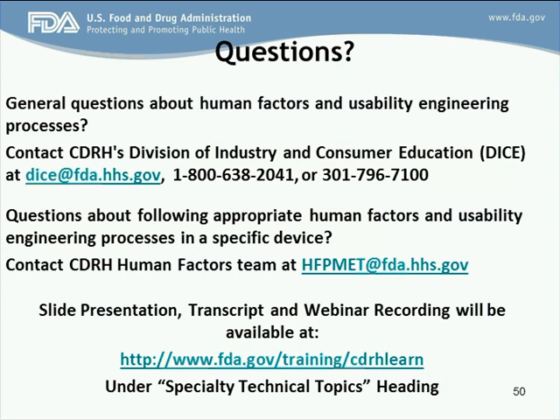Hi. I work for a division of a company that makes software medical devices, and I had a question regarding the timing of the human factors studies and data. Typically, design validation, which early in the presentation you emphasized that human factors fell under, is done toward the end when your design has been locked down. But modern software development is iterative, and some parts of the design are still evolving while other parts have been locked down. Do we have to wait until the end to obtain our human factors data, or can we do that iteratively in line with the rest of our product development methodology?